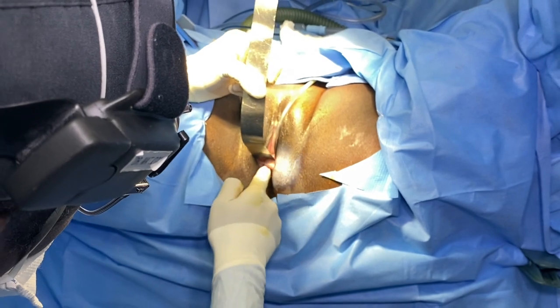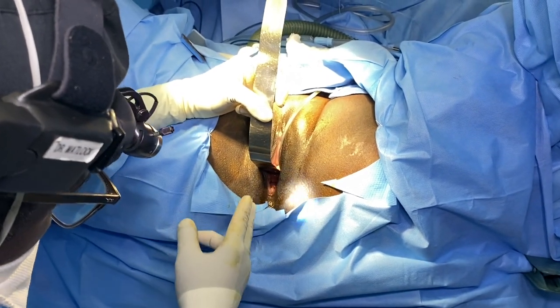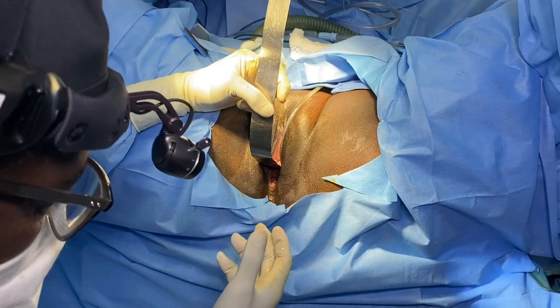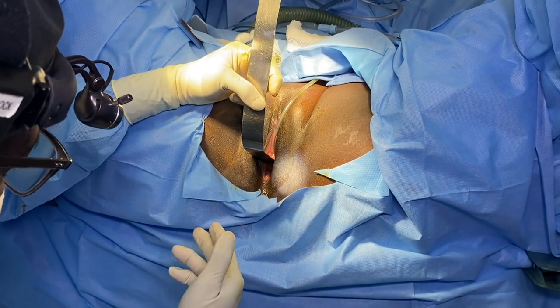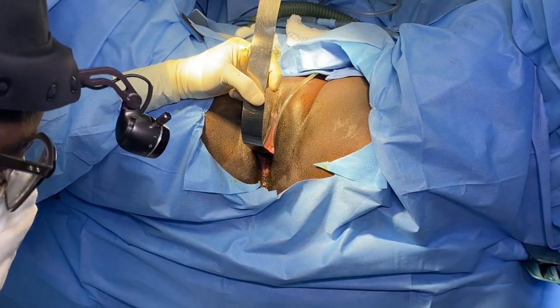We're going to repair everything top, bottom, outside, bring the muscles back together, top, bottom, and outside. She wants to be as if she never had children before. That's how tight she wants to be. So we'll bring you back and forth so you can kind of understand the procedure.